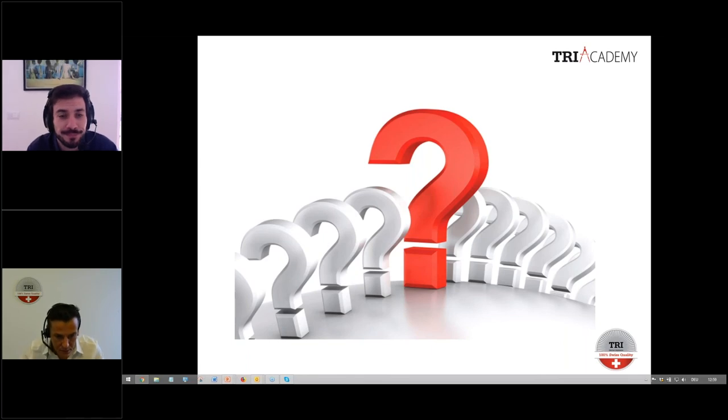Then there's another question from Suraya Ahmad. If the socket shield is mobile, can we still use it? No. Take it out. Okay. Clear answer.